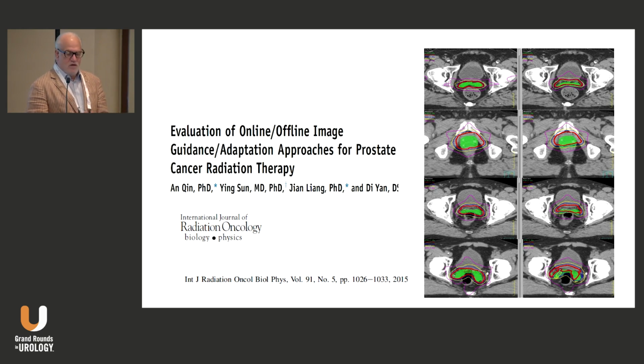Now let's look at the second row, a prostate. You can see this is a bigger change, where the prostate neatly fit into that red line, which is the dose that you want. And now when you take the patient and you look at it and you superimpose that dose, you can see that now it's outside of that. So there is a problem here.